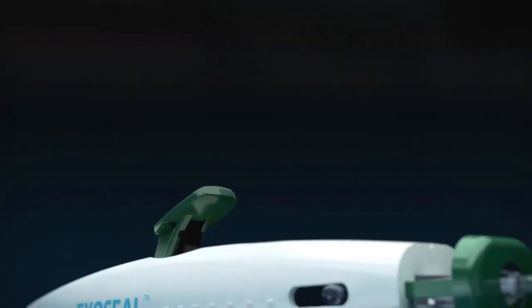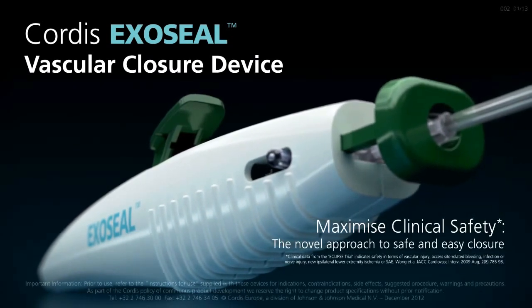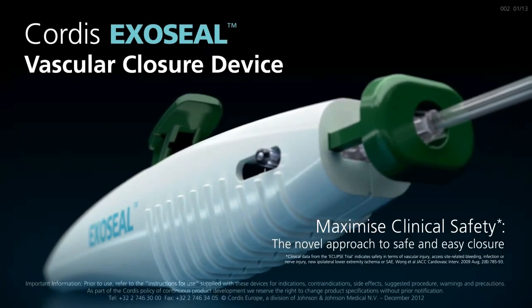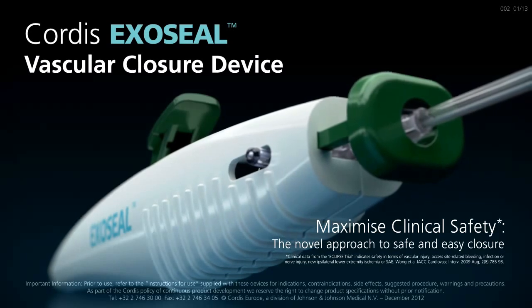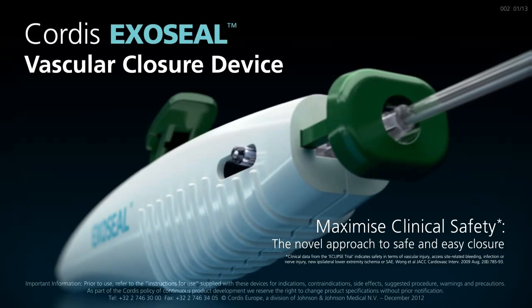The ExoSeal vascular closure device is designed for a safe, simple, and secure closure, offering an ideal combination of benefits that result in faster time to hemostasis and ambulation than manual compression, with a low risk of major vascular access complications.